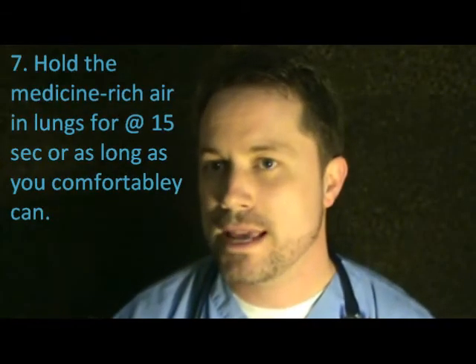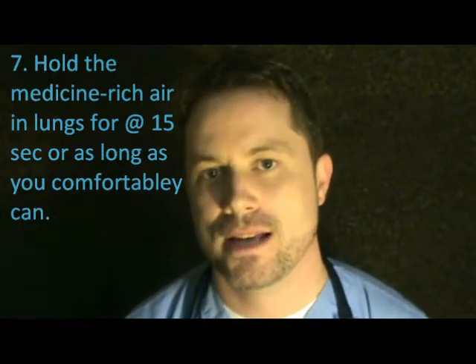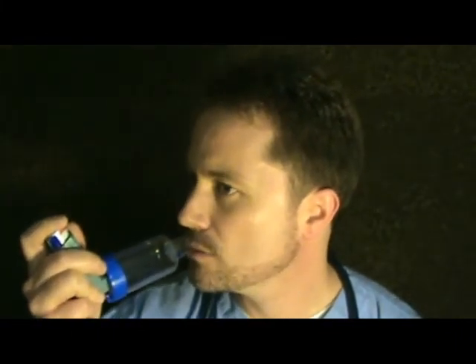It's important, once you take that deep breath all the way in, to hold it for as long as you comfortably can. That'll allow the medication to attach itself to the lining of your airways, to where it needs to expand and dilate those airways open. If you just puff it and blow right back out, you're going to exhale most of the medication back out into the atmosphere. It's not going to be as effective. So, shake it up, pursed lip breathing, put it in your mouth, squirt it, wait a second, and then a slow, deep breath in, hold for as long as you comfortably can, and then exhale.